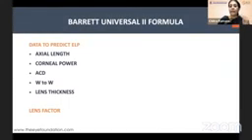Like you can see here, for a normal eye, you need a T5. For a small eye, you need T4, and for a large eye, you need a T6 toric IOL. Now, that is where the accuracy is challenged. When you look at the Barrett Universal formula, you realize they come up with 5 variables to predict the effective lens position of the eye.